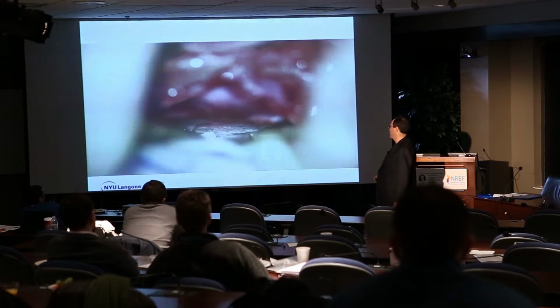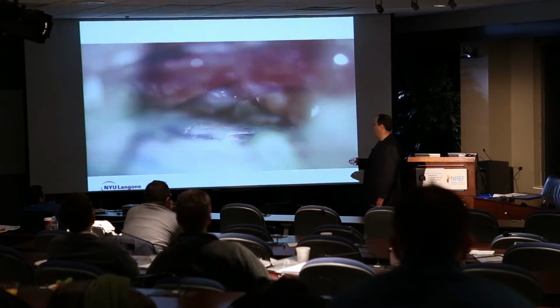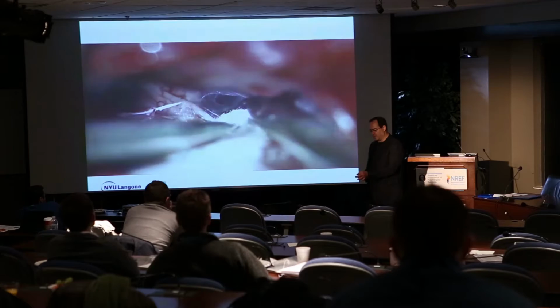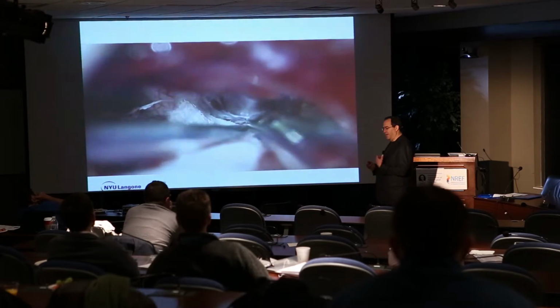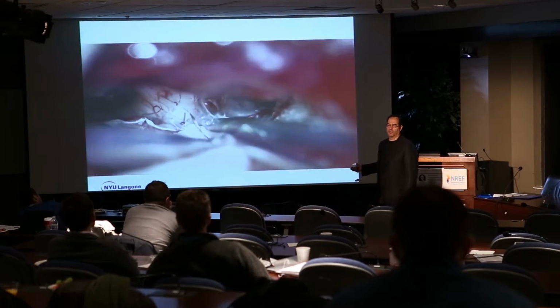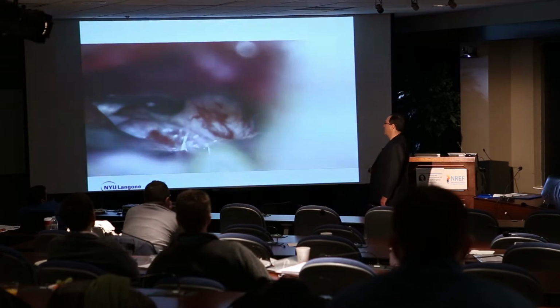So first we start here, you see the dissection. With the eyebrow incision, we do go and open up over the optic first just to get some CSF out, because that's how you're going to get the relaxation that you need, because it is a much smaller cranium. You need to get a little bit more brain relaxation. As I said, I don't use retractors, but in this situation, you can't get a retractor in there because it's only a 1 centimeter plus craniotomy.